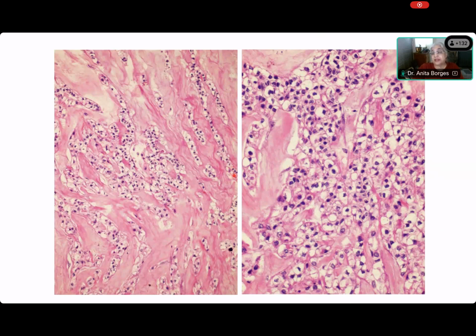That is a trabecular pattern, and in between these trabeculae, what are you seeing? What are you seeing, Somik? You can see this. You see the tubules or you don't see the tubules? Oh, you do? Okay. Tubules, and in between these, tumor cells are present. The tumor cells are formed around hyalinized stroma, Somik. And in between, what do you have? What is this stuff that is pink? This is hyalinized stroma. Hyalinized stroma. And what are the cells like, Somik?